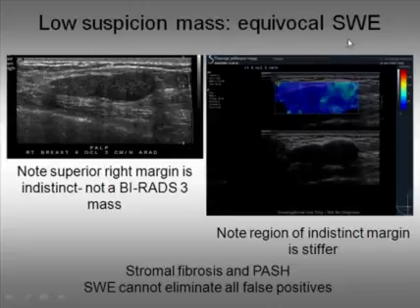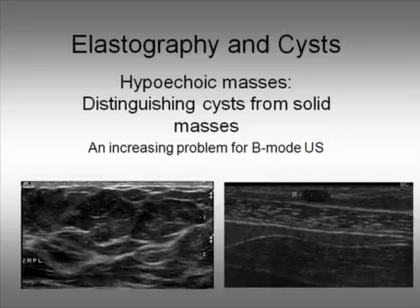So shear wave elastography is not going to completely eliminate benign biopsies, but that's okay, because if we can eliminate a significant percentage of them, we really are still advancing patient care.